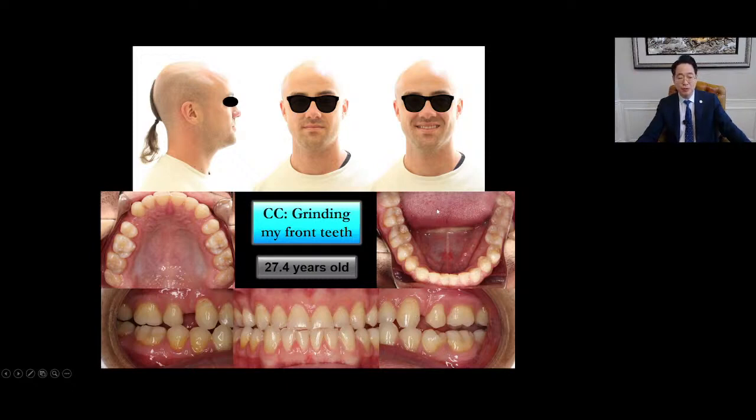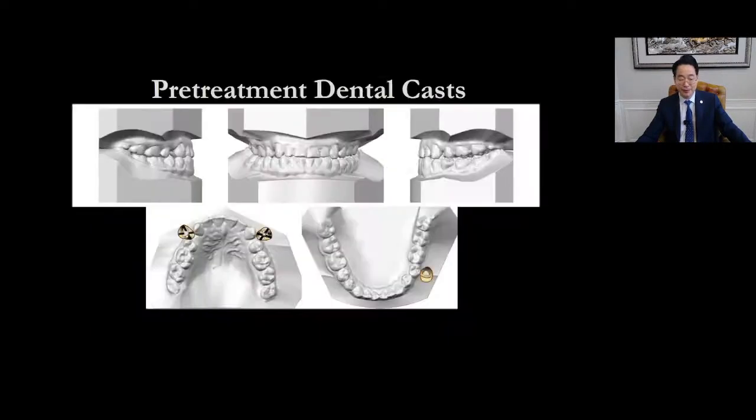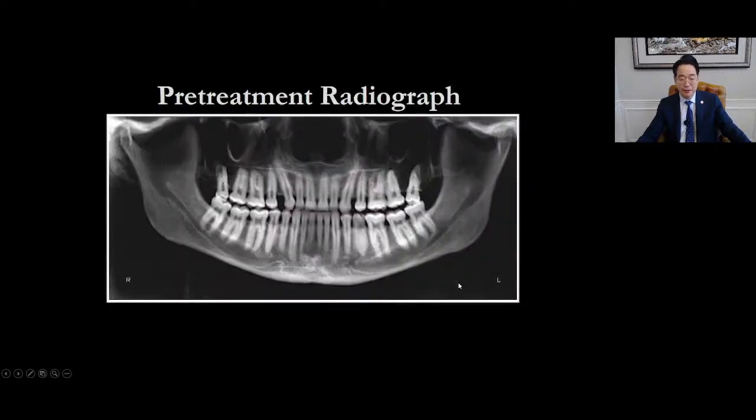He was observed to have a lateral tongue thrust habit with forced opening of his lips when swallowing. You can see he is missing upper 4 and there is rotation of the lower left 5. The upper right 3 root was close to the upper right 5 root.